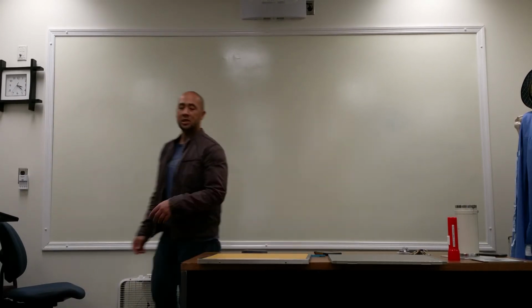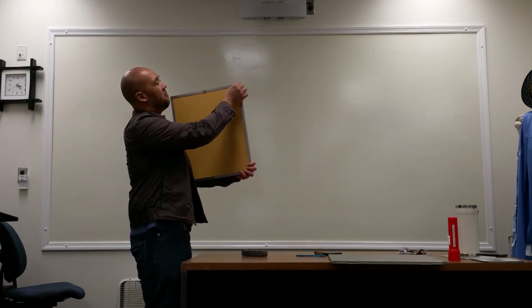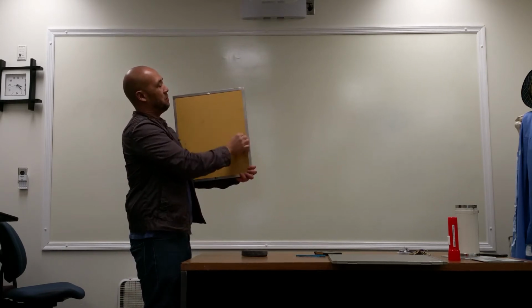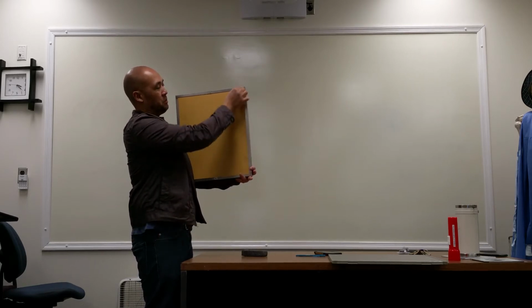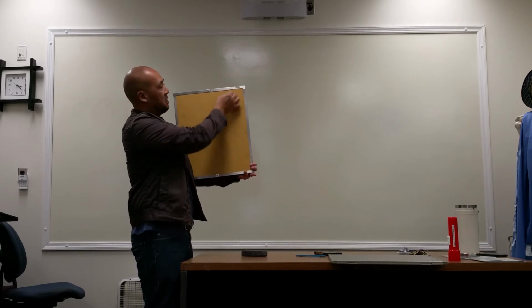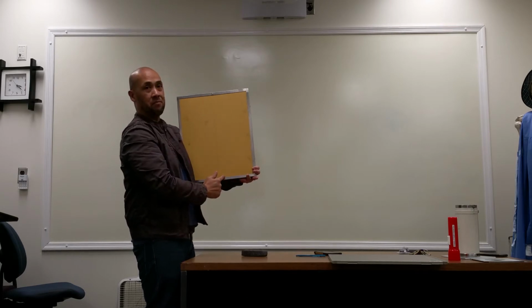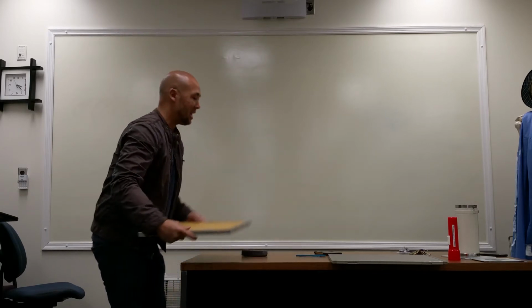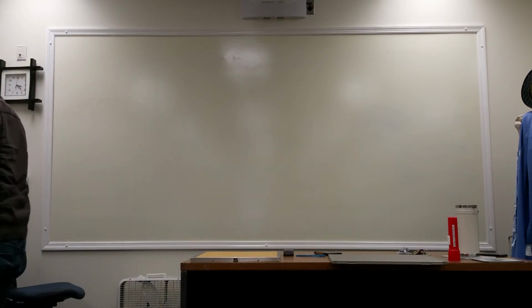All right, so the way these grids work is you have very thin strips within the construction of the grid, very fine leaded strips going down the length of this grid right here. So it goes to the length of this grid, okay? Very fine lead strips.